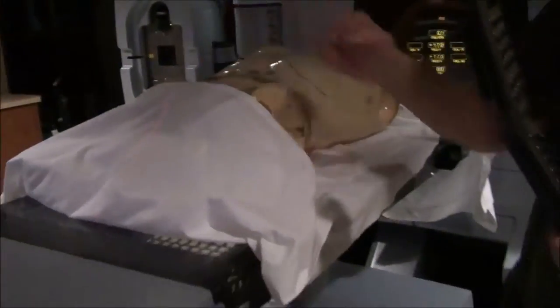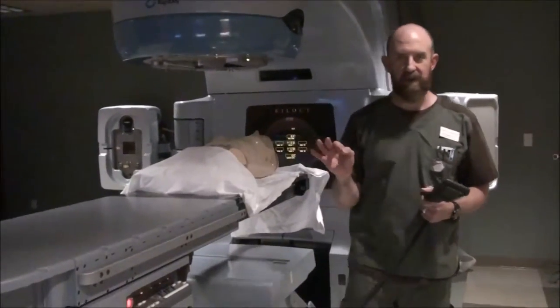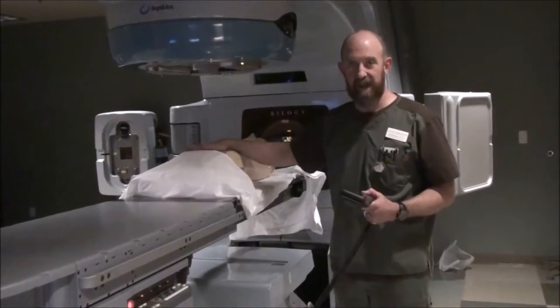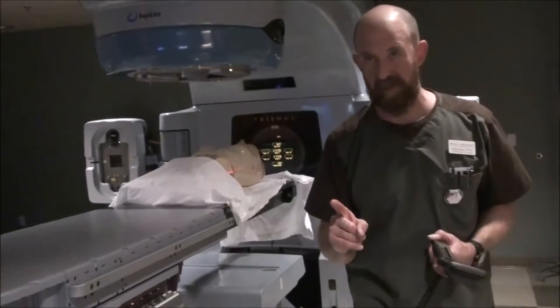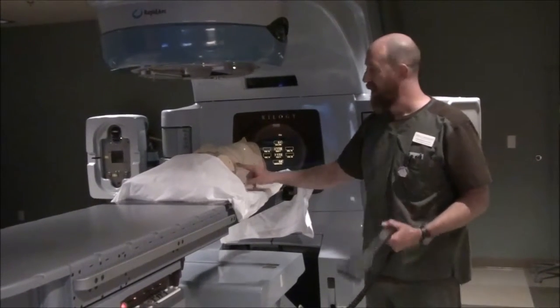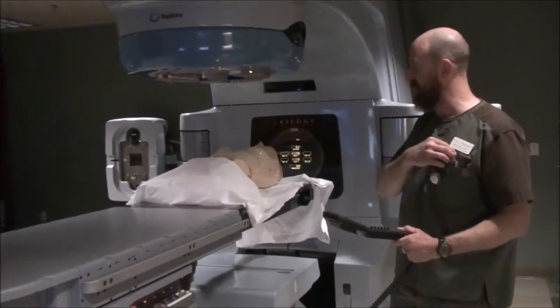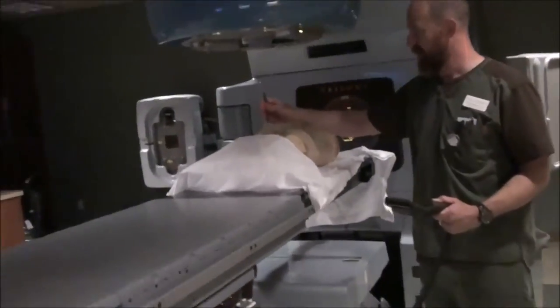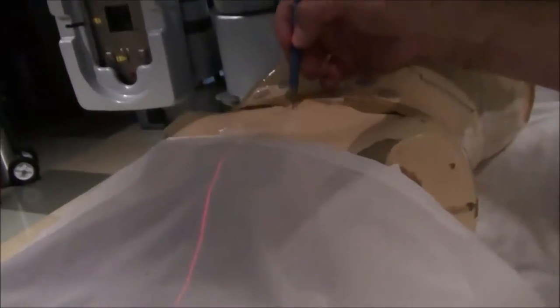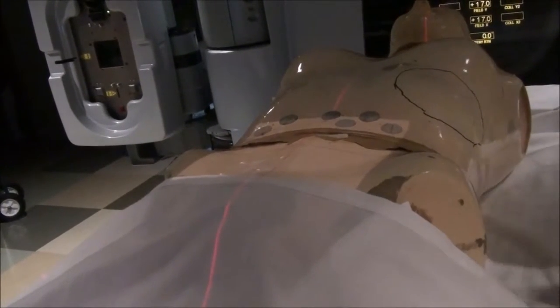There are going to be two parts to this. We're going to go out and fluoro the AP. Once you decide exactly where you need to be, call the doctor — the doctor will fluoro and do some minor adjusting. Once that's done, notate everything except for the vertical. We don't know how deep we're going to treat yet — all we've done is ballpark up and down. Come in the room and put a dot right where the CR is. We don't want to mark it just in case we have to move it.